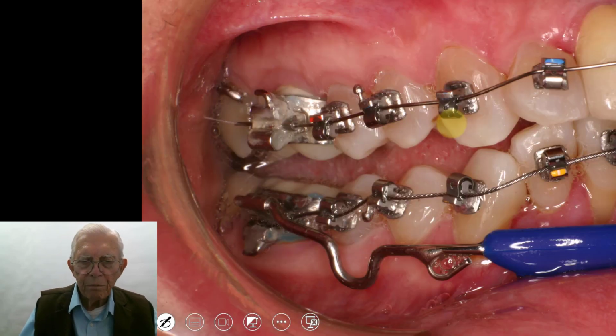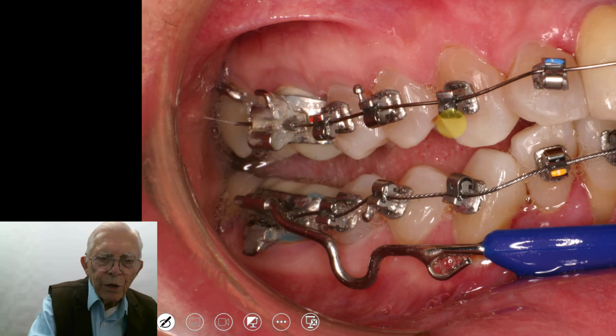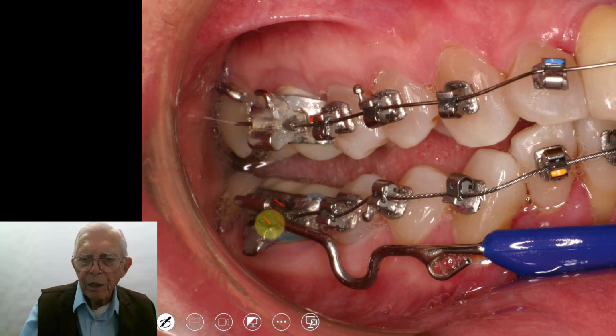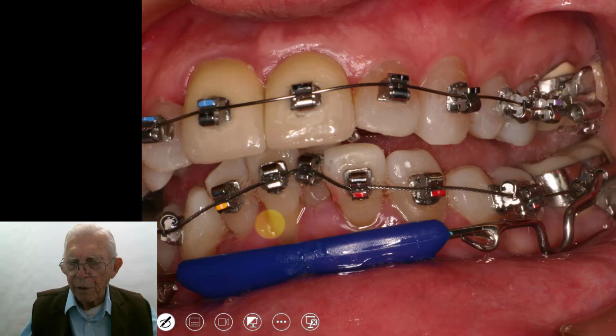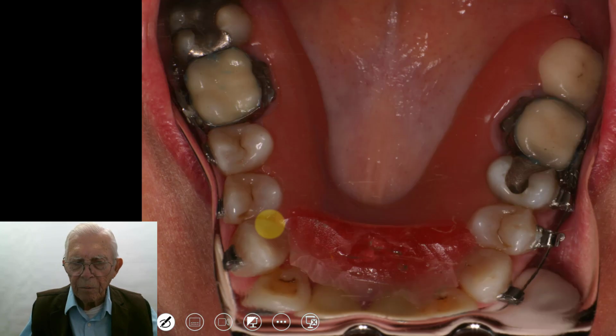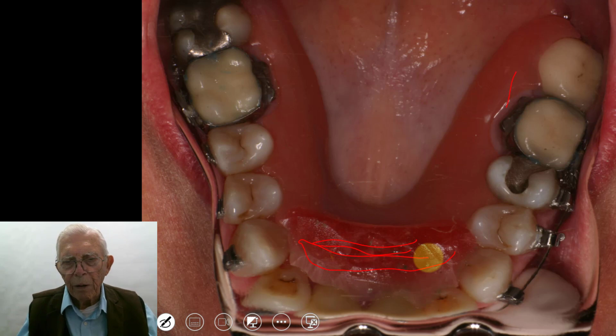This is a bought lip bumper. I don't like to use them. I like to just run a double arch and make the lip bumper out of a rectangular wire. Here we've got the lip bumper, and we're going to level this bite out. And up above, we'll put a bite plate with a little ramp on it.